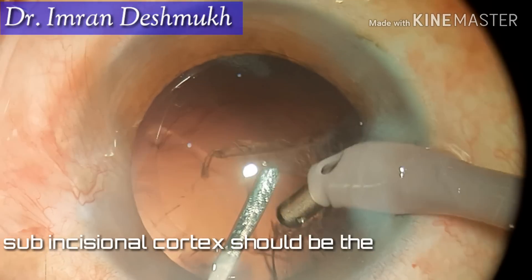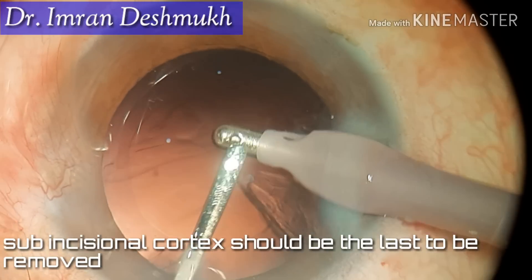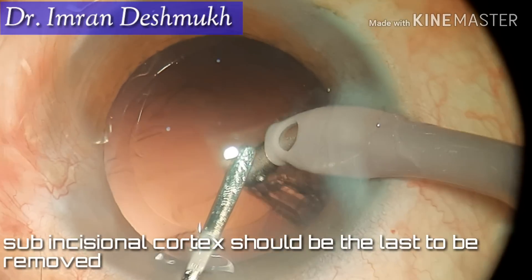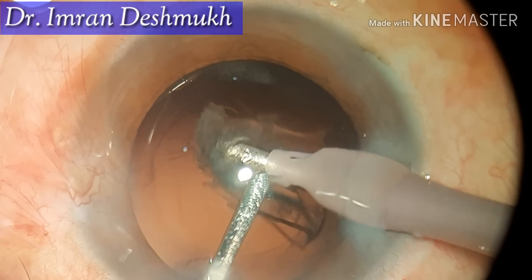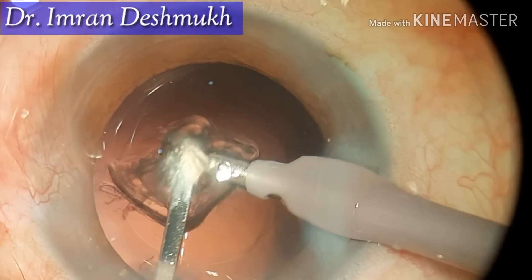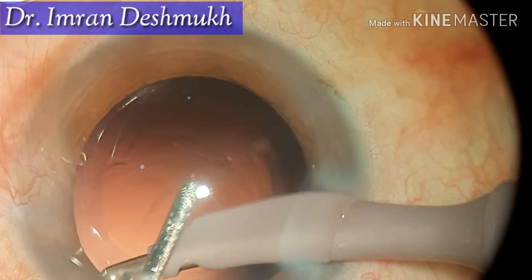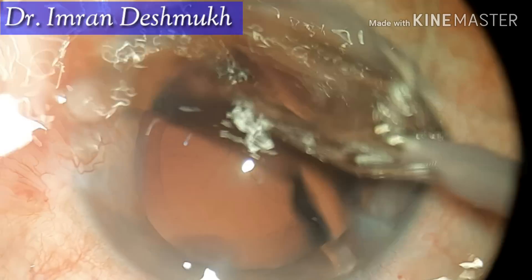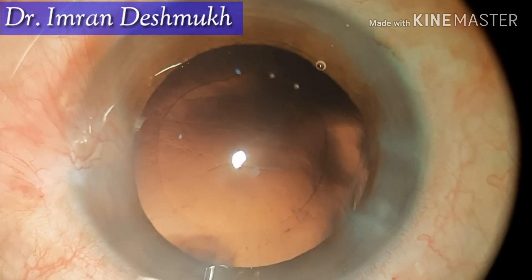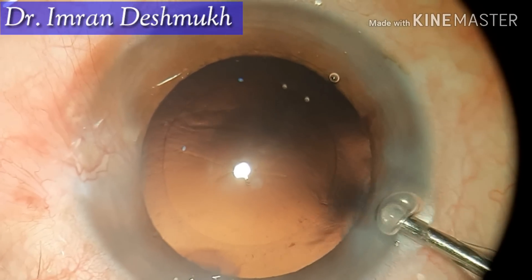The sub-incisional cortex should always be the last part to be removed. If you're having trouble removing that part, you can place the IOL in the bag, rotate the IOL, and then remove that cortex — as the IOL provides a barrier between your IA tip and the posterior capsule, which makes this part much safer. I hope this video was helpful, thank you very much.